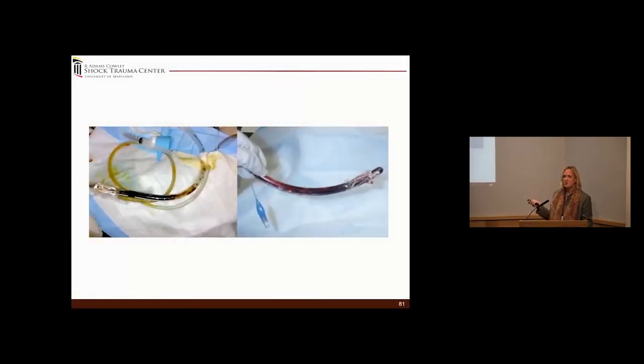So pulmonary contusion started breaking up, and this endotracheal tube became full of bloody secretions, and the interesting part was it created a one-way valve. So it was thick bloody secretions, so you could pass the suction catheter in, right? But when you came back out, it actually collapsed. And so gas is going in, gas is not coming out. So this is where you would stack. It was actually interesting because you could tell from that waveform. We checked everything else, that patient got re-intubated and everything was resolved.